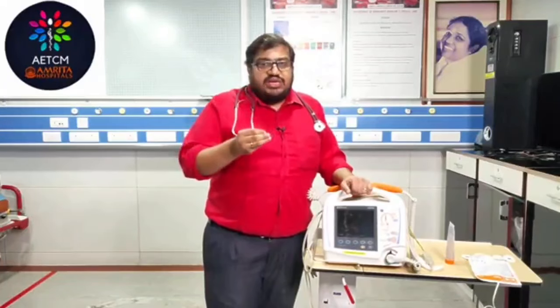After procedural sedation, after explaining to the patient, maybe you need to clean the chest also. If there is very much chest hair, it might not deliver the shock properly. Maybe you need to clean that area, and then you need to deliver the shock, and see how the patient is responding or not.